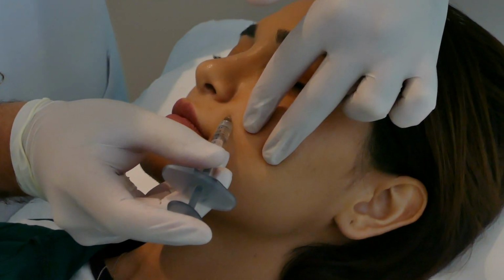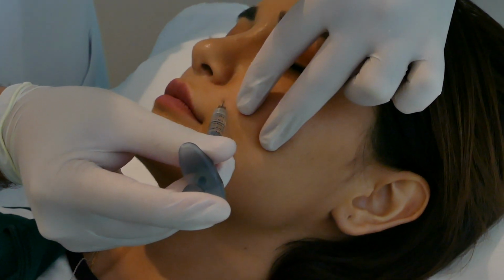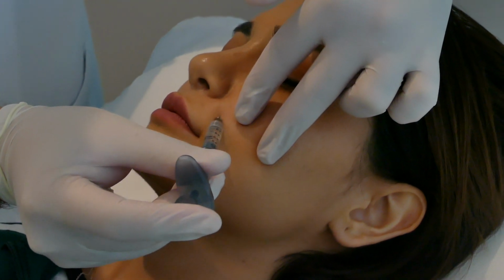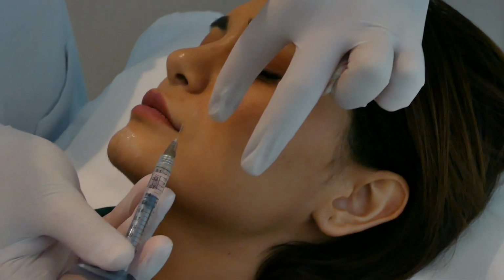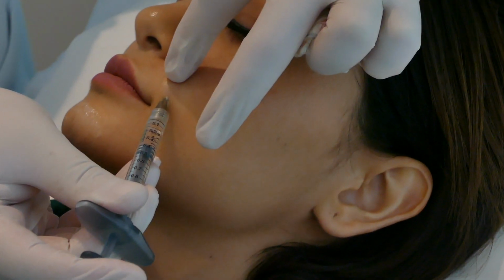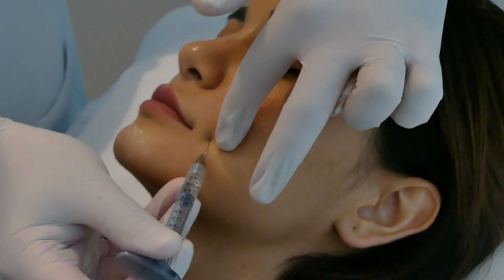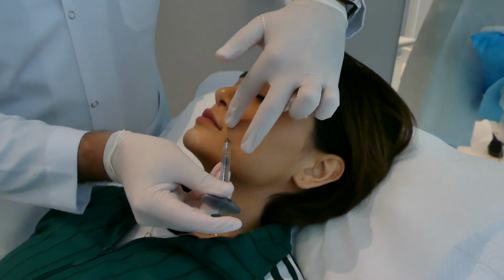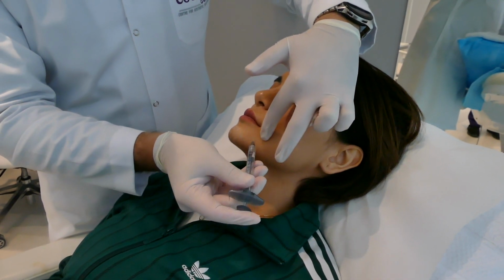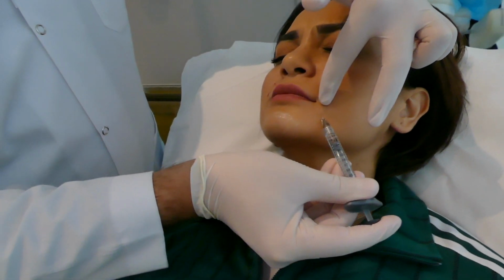This is the other side of the nasolabial fold, upper third, fanning technique in the subcutaneous plane, and an amount of about 0.2 to 0.3 cc is enough to give a good fullness without lumpiness. Then the middle third, very superficial, just about 0.1 ml of filler placement. The lower third, subcutaneous, again a small quantity. So usually about 0.5 ml on each side is good enough for a good nasolabial correction in grade 1 nasolabial fold.